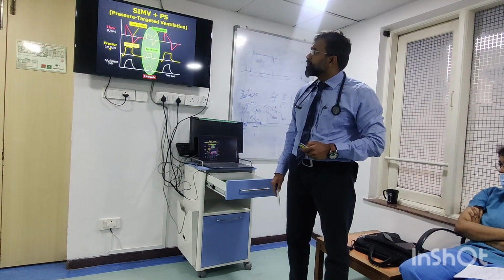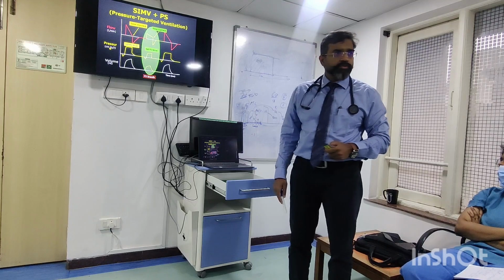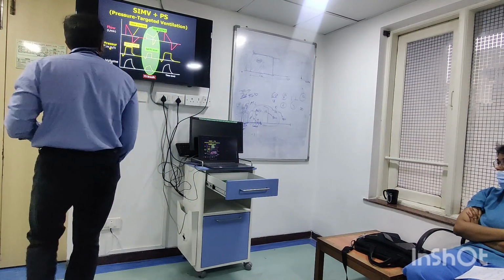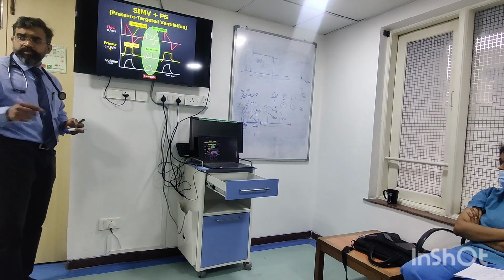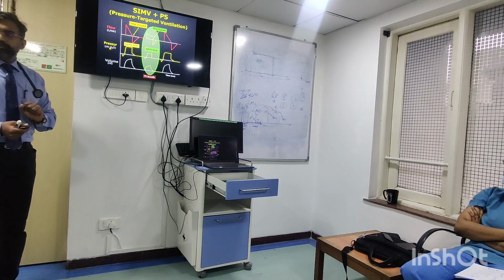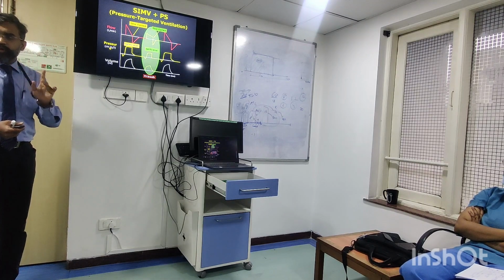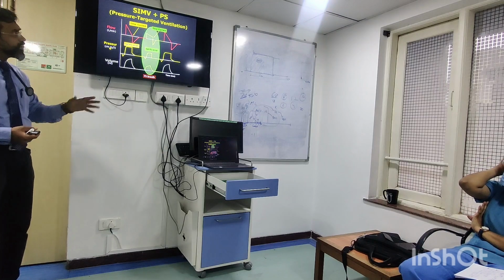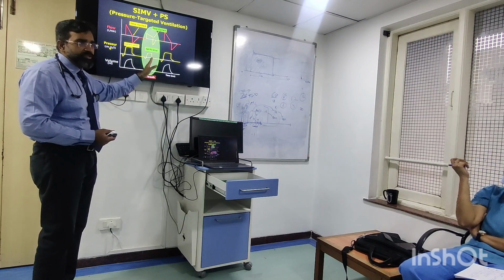Now what is happening here? So Amit, can you tell me what's happening here? Or wait, you answer, Smita. Trigger. So is there two breath types first? First to answer whether there are two breath types, or is it just one breath type? There are clearly two breath types. There is one breath type here, one breath type here, which is different.